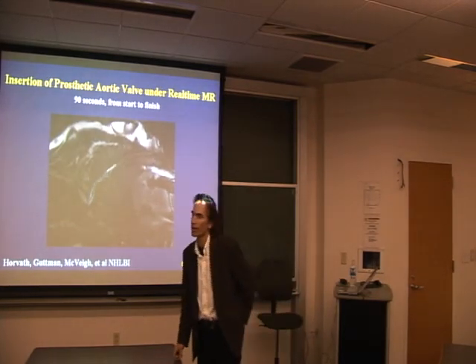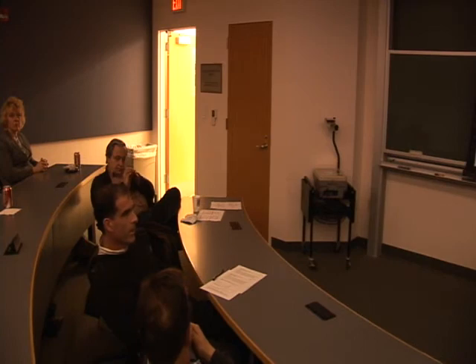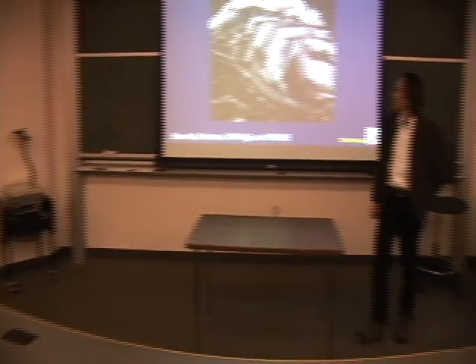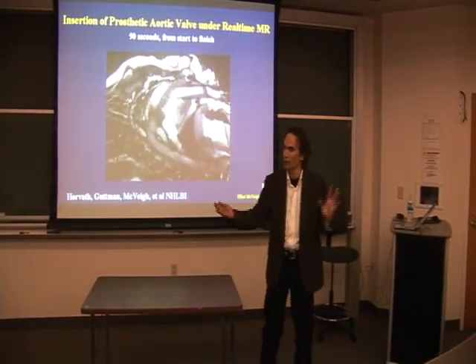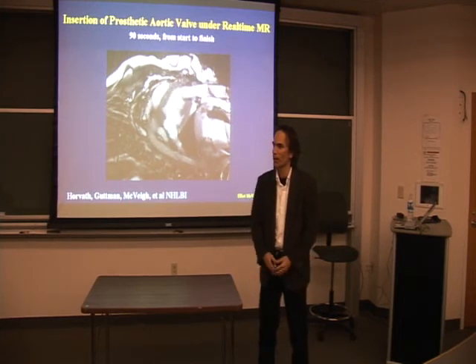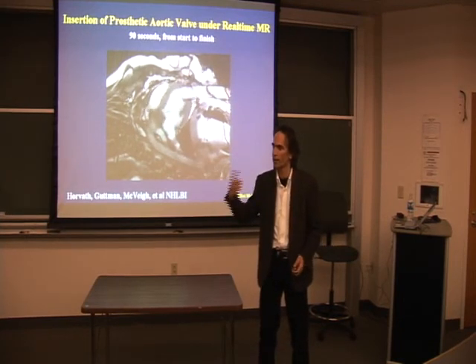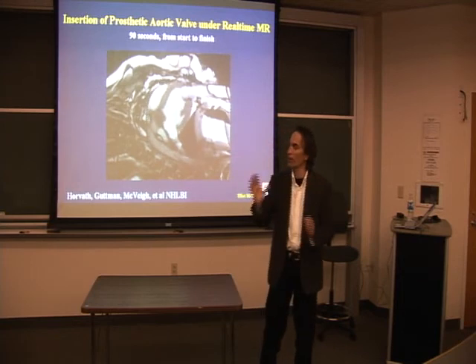I'm just interested, you're willing to threshold it, because you're interested in maximizing temporal resolution. What kind of frame rates are you looking at? Well, that's an interesting question. If you let me scan it for 12 minutes, I can give you 5 millisecond high resolution if it's a repeated event. So, it's a strange question.